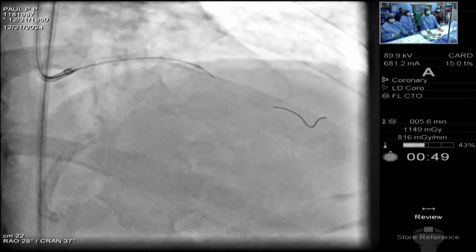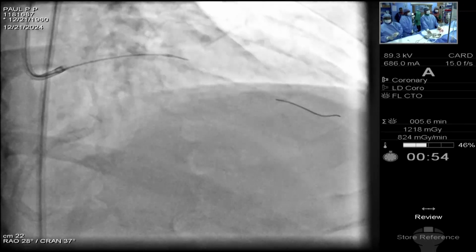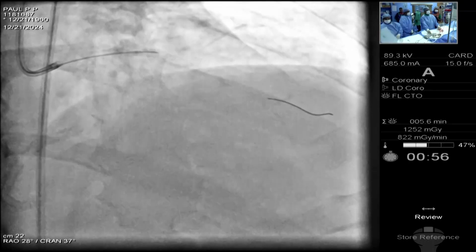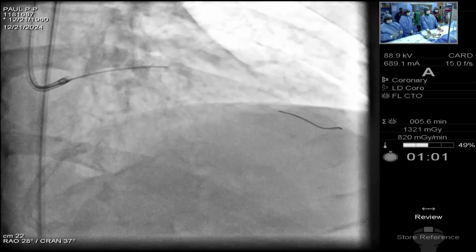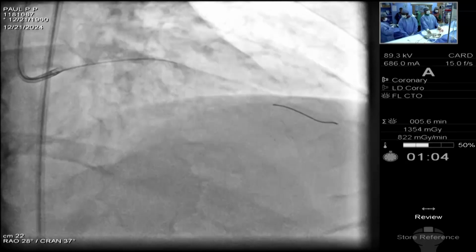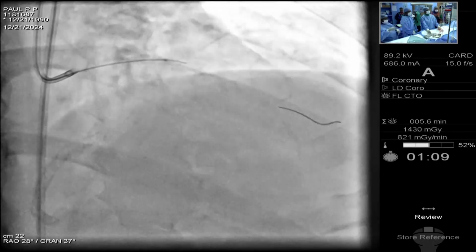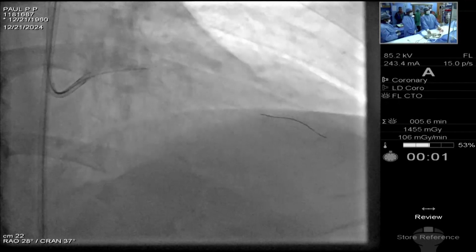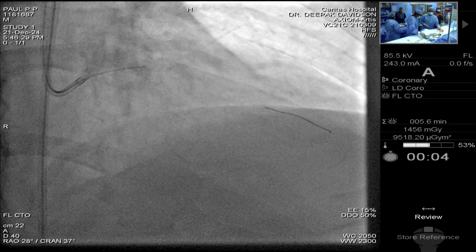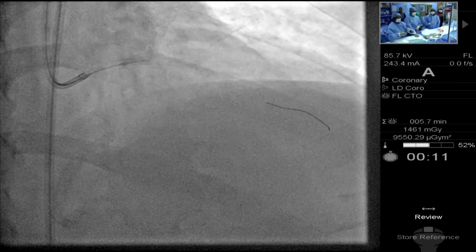Till there. But there we are not hearing any change in pitch in the distal portion. If so, proximally, get a 3 balloon rather than a 2.75 balloon. Higher pressures, higher speeds. Now we'll go at 120,000 RPM.